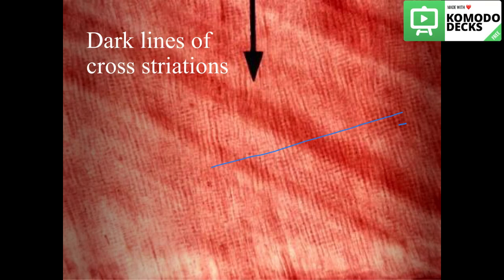And we said before that they represent an almost daily rhythm of enamel formation or mineralization. They can be seen only at very high magnifications. Again, cross striations pass the enamel rods at 90 degrees.